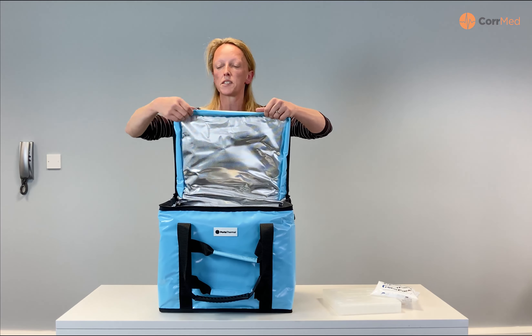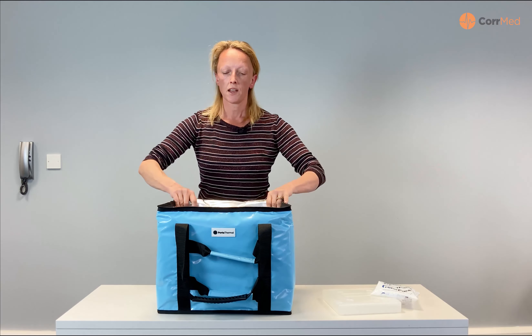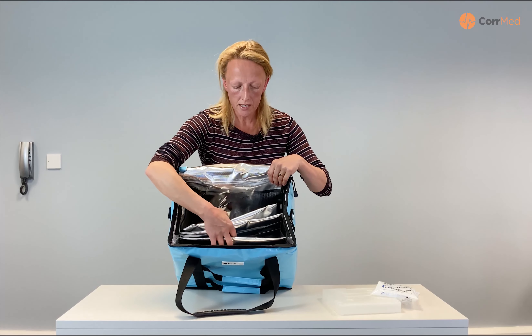You'll see how easy it is for that trolley to store away. The bags have been made with 250 denier tarpaulin, so they're really tough and durable.